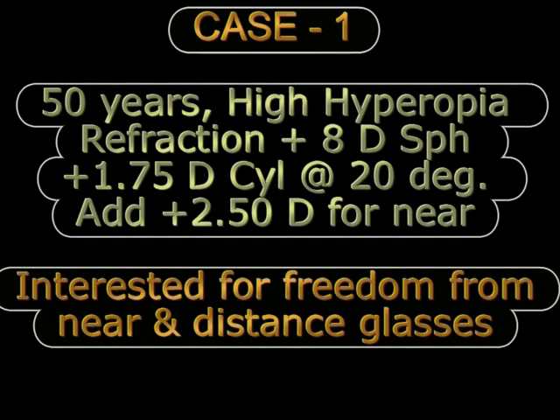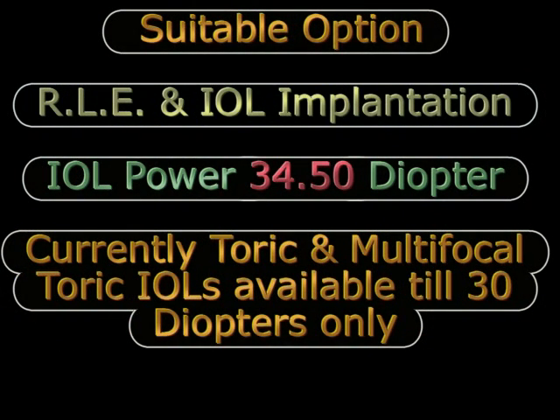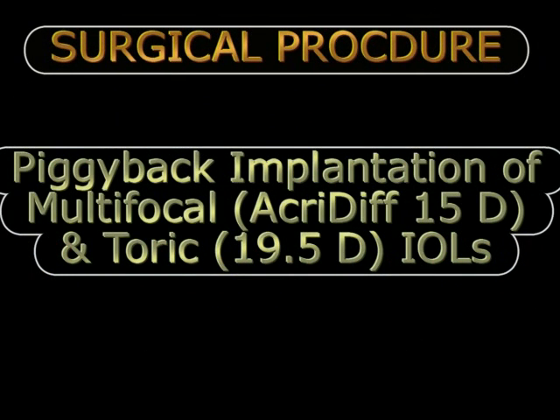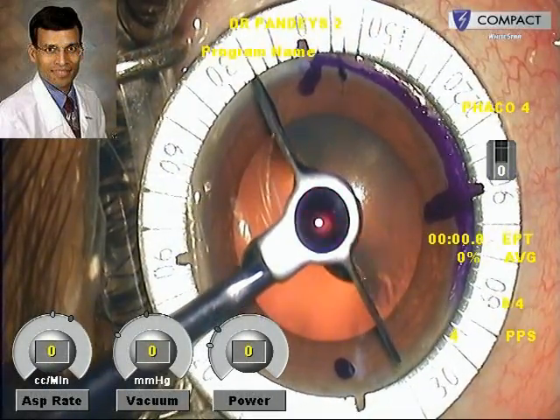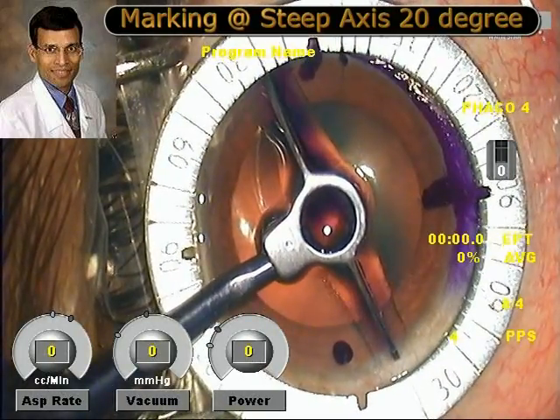This is a case of high hyperopia with a refraction of plus 8 diopter sphere who wanted freedom from glasses. The IOL power calculated was 34.5 diopters, and because toric and multifocal toric IOLs were available only up to a power of plus 30 diopters, a piggyback implantation of a multifocal and a toric IOL was done to achieve spectacle independence. This is the surgery being performed, with marking of the steep axis as is routine practice for toric IOLs.